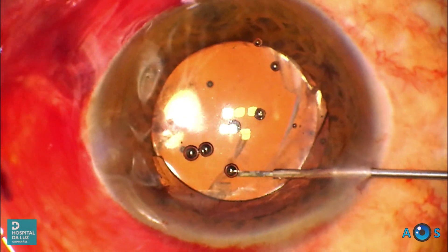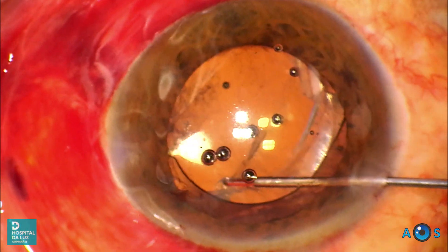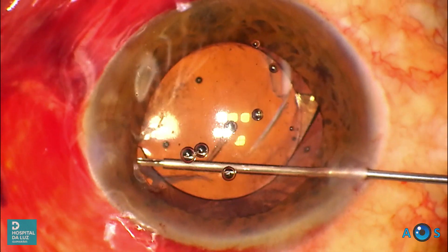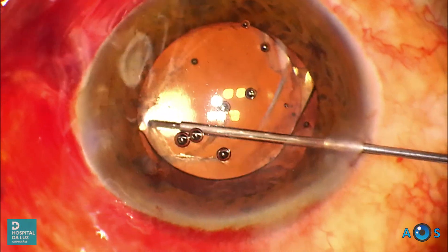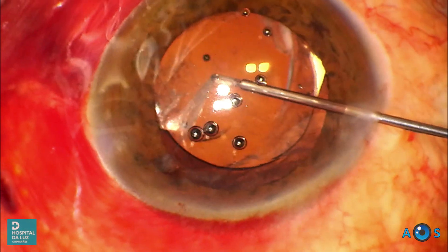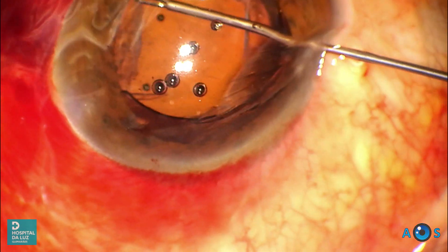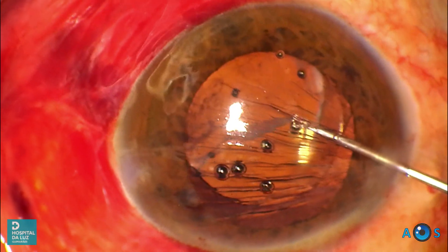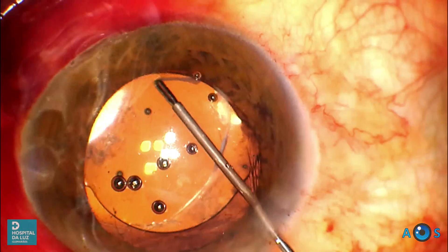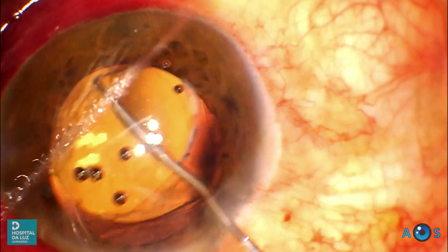The IOL is now nicely centered, but we will further work the bag by using a 25-gauge micro forceps to peel the fibrosed cellular strands from underneath the anterior capsule. Peeling is slow and controlled in order to avoid creating a break in the elastic but brittle capsule.